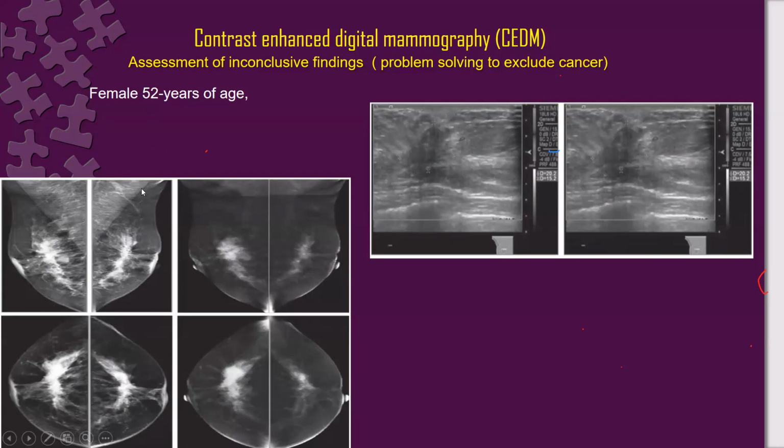Yes. If we look at the low energy image or regular mammogram, we can say there is high density asymmetry bilaterally. Irregular asymmetries on both sides, more on the right side, associated with long spiculations going toward the nipple with some thickening and going back to the posterior breast.